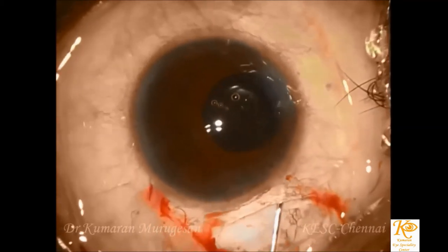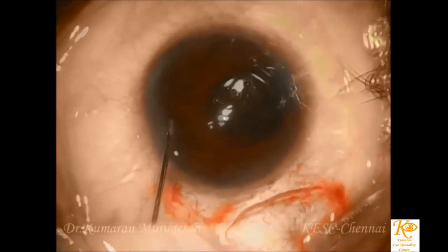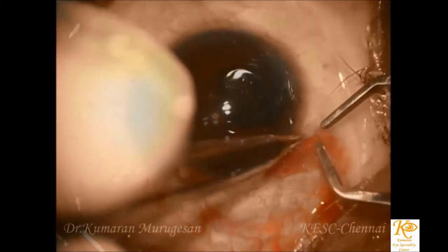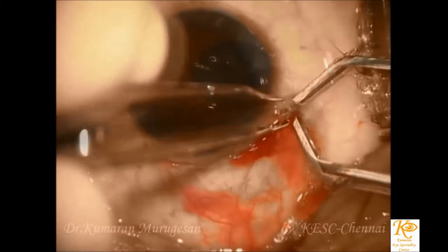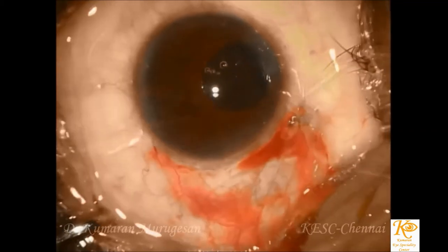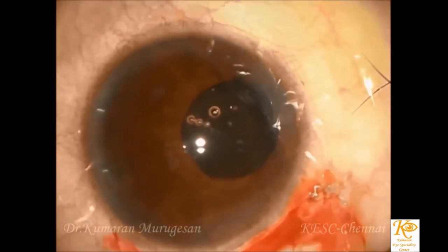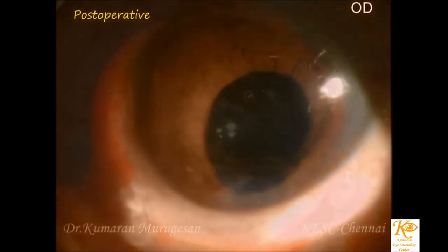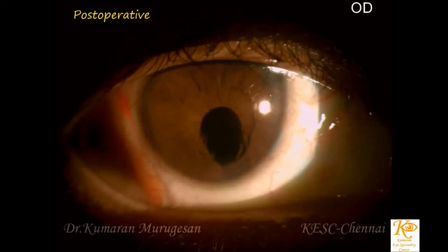This video has been presented due to the lack of literature demonstrating the safety of small incision cataract surgery in hypermature cataract with coloboma. The combination of coloboma and white cataracts can be challenging, and this video demonstrates that small incision cataract surgery can be a safer alternative to phacoemulsification in these cases. This video could be helpful to all postgraduates and practising ophthalmologists.